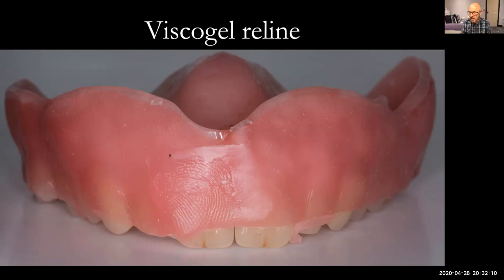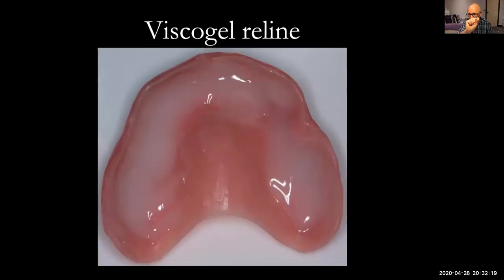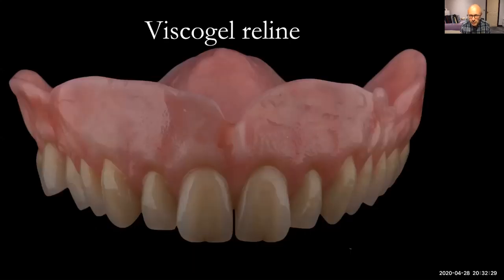I trim the Visco Gel afterwards with a scalpel blade. But we pop that in. That's the Visco Gel in the fitting surface. It's got the wax on the outside. Pop that in, do all of that, and then take it out and clean it up. And it comes up like this. It's really good. So that layer of wax is a really useful tip, and it'll save you loads of time if you don't do it already.